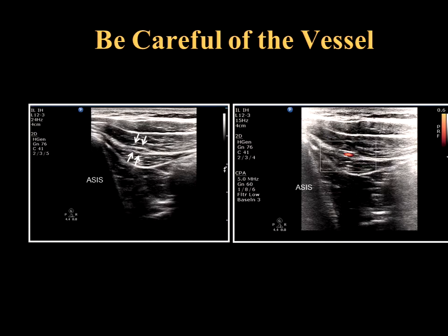Without Doppler you can see external oblique, internal oblique, transverse abdominus, iliacus, and peritoneum, and a structure that you might consider to be nerves. Once you apply the Doppler function, you can see that structure is actually the deep circumflex iliac artery.